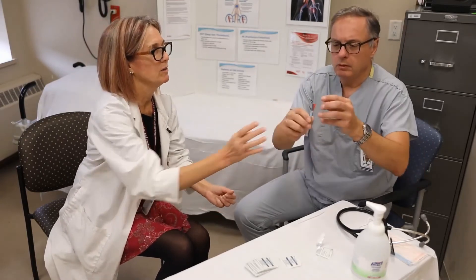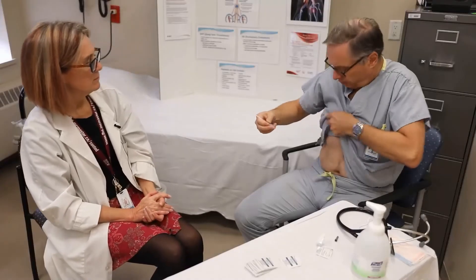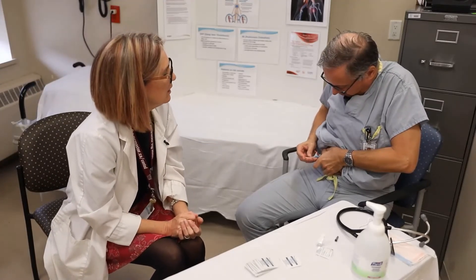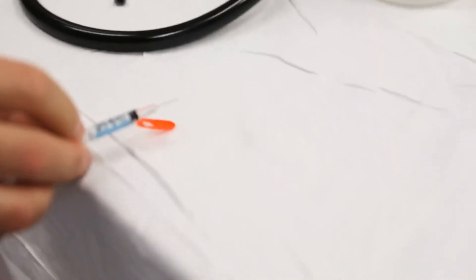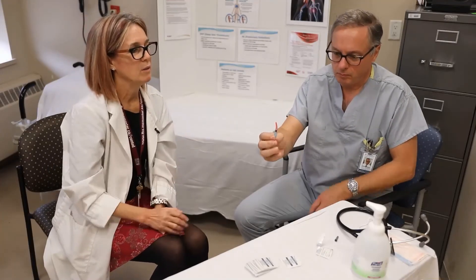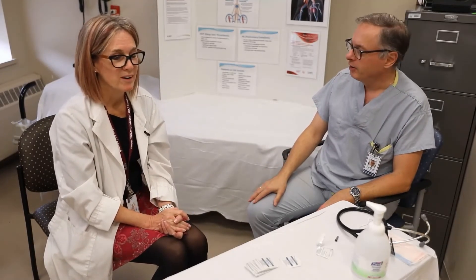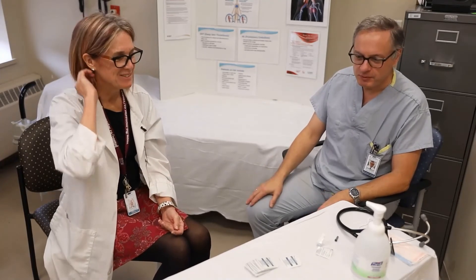Go ahead — just pull off the top and hold it by the barrel. Pinch an inch and inject straight in at a 90-degree angle, just like a tee. Keep pushing the plunger all the way down. When you're done, push the needle into the guard — it's a safety measure so that you don't poke yourself. That was pretty easy! It was fairly straightforward — I really didn't feel it.